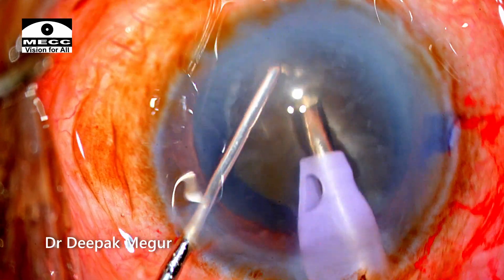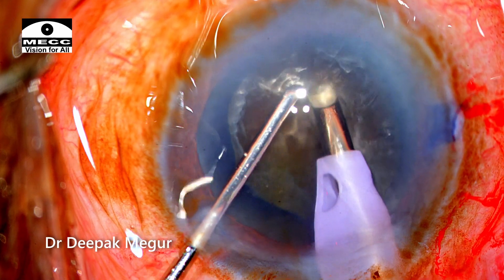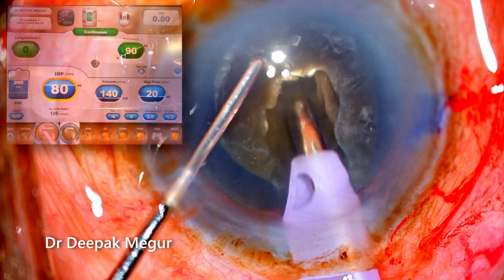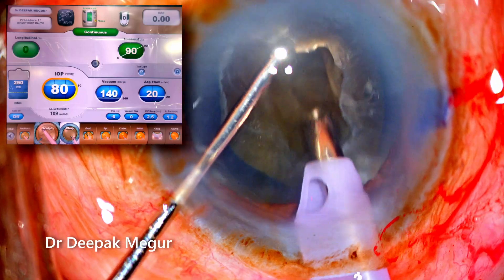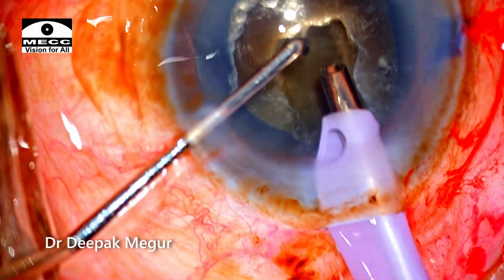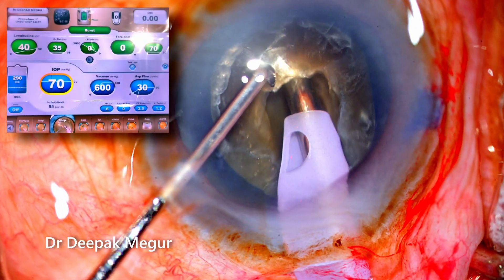I begin by sculpting the central core of the nucleus to create a central pit, which will allow access to the deeper part of the nucleus. Please note the settings: I am using 90% continuous torsional power while trenching. After creating a 50% depth pit, I shift to chop mode for dividing the nucleus — and this is where the difficult part actually begins.